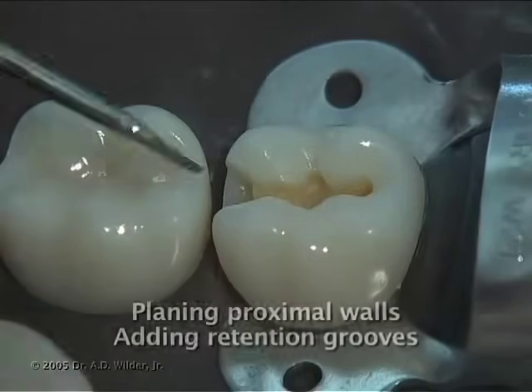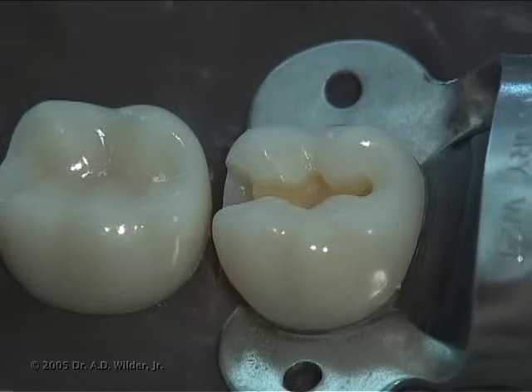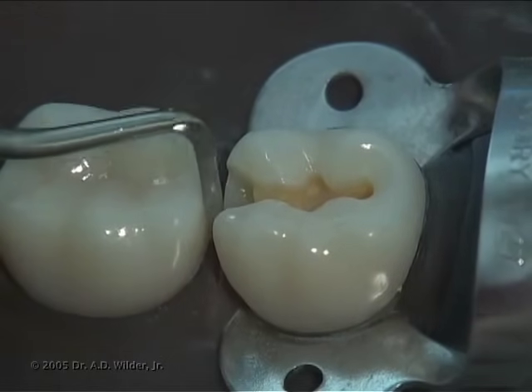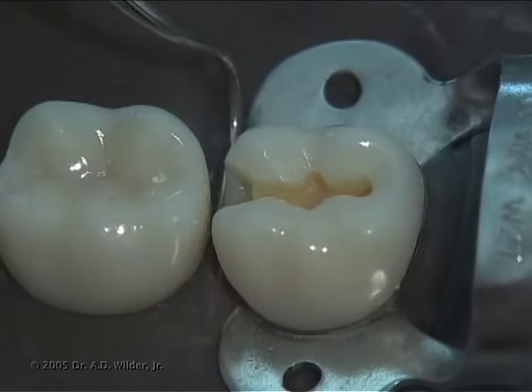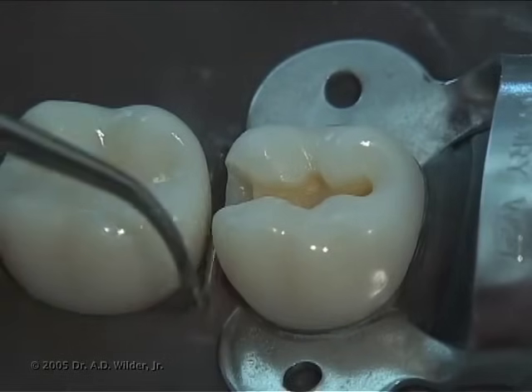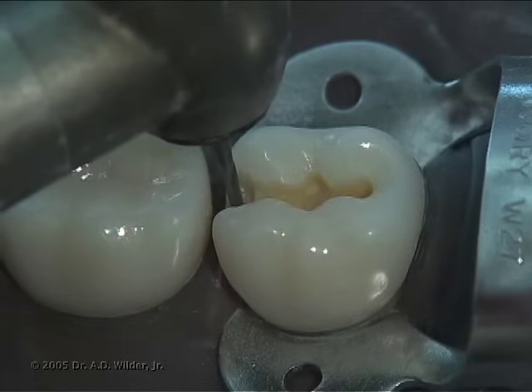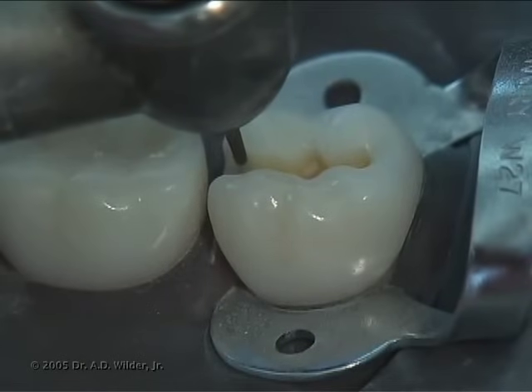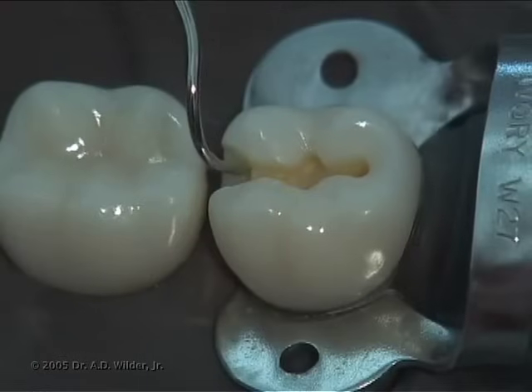We can now remove the wedge and smooth the preparation walls. Due to the round shape of the burr, it's very likely that you'll leave hooks or spurs of enamel at the corners of the proximal box, so return to and refine the proximal box, smoothing both the gingival floor and axial walls with an enamel hatchet and other hand instruments as needed. Using the tip of a 169L burr or quarter round burr, you can prepare retention grooves at the corners of your proximal box just inside the dentin enamel junction to improve retention. You can verify this with an explorer tip to see if it catches.